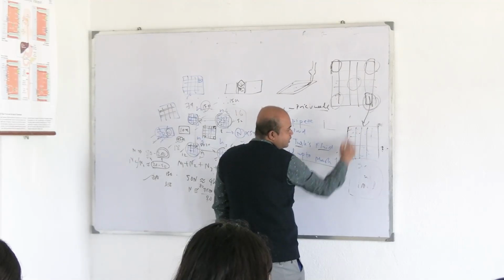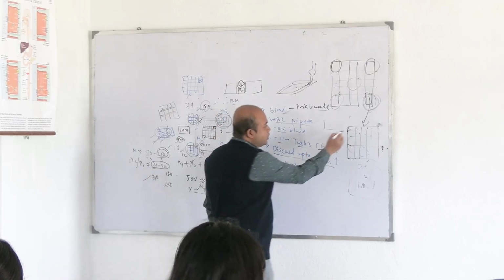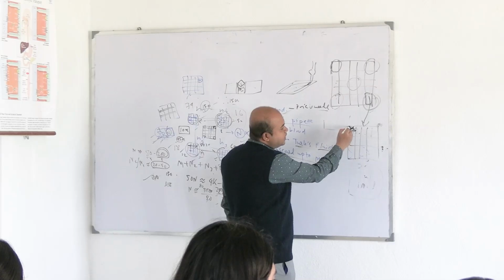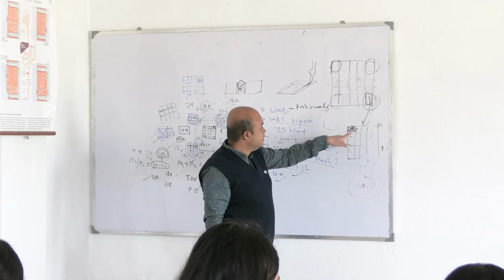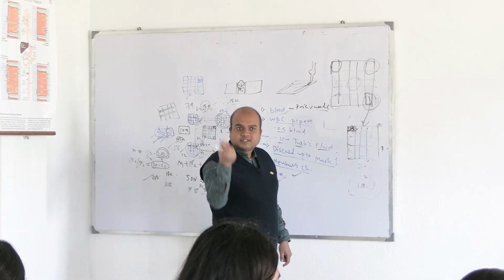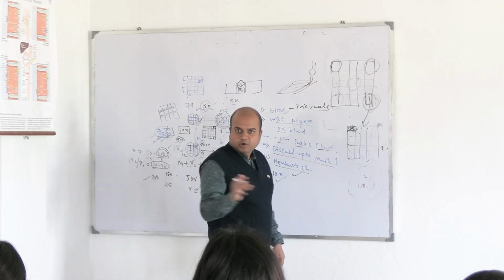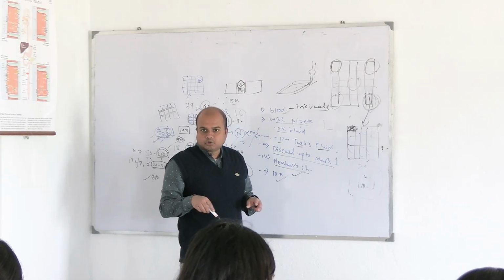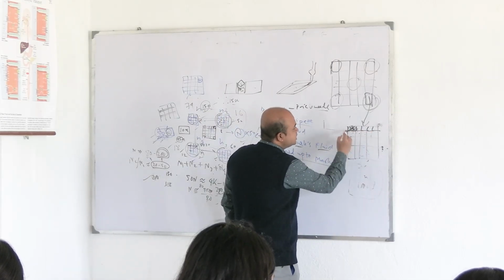Say this square I am counting. We take the rule of L when we are counting this particular small RBC square. We count on the left and the lower side, but avoid the right and the upper side. The reason is, if we try to count all the margins, then since the cells are so small, some cells may be counted twice. To avoid that, upper and right margins are left out. You get this? Some cells may be lying on the margins also, so those cells are not counted twice. After all the cells following the rule of L, this is done.